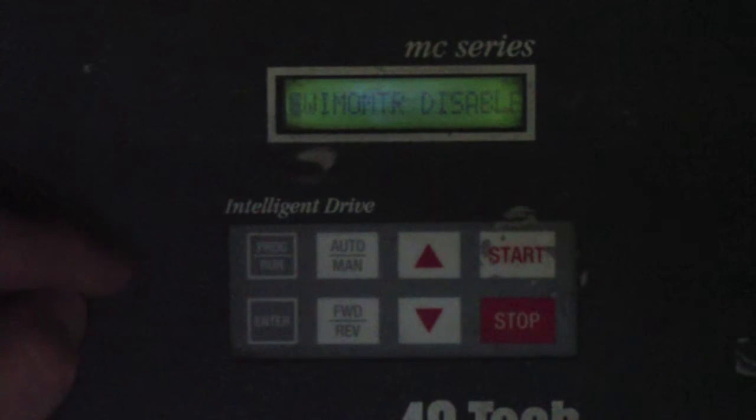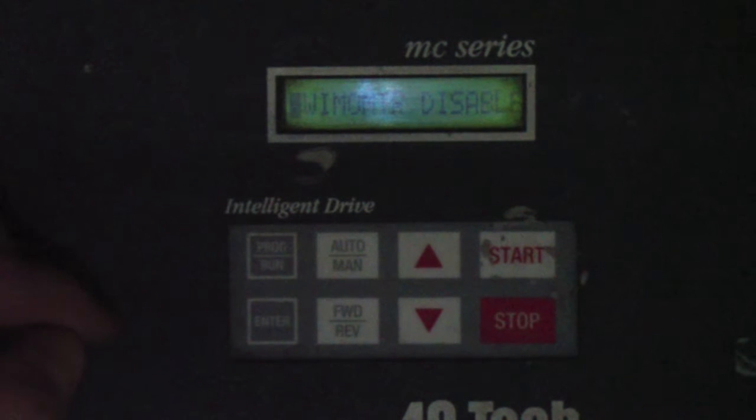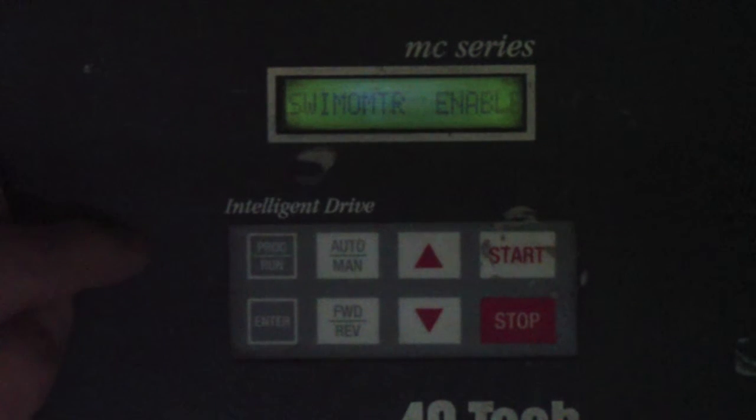If you didn't have the Swimometer option, you would leave this parameter set to the default, which is Disable, and then press the Program Run button to return to the stop screen. We're going to assume we do have the Swimometer option, so we'll hit Enter, cursor goes over to the right, hit the up arrow once — it will now read Swimometer Enable — hit Enter, cursor goes back to the left showing Swimometer Enable. Hit the Program Run button and we're back to Stop 5 Hz. This completes the calibration procedure for your AC-TEC.